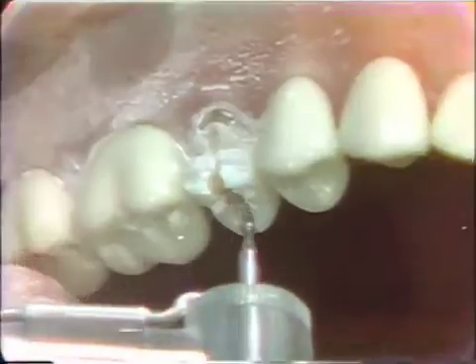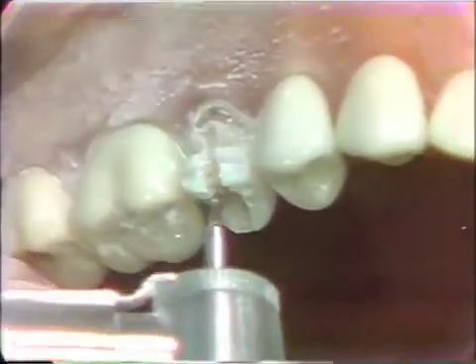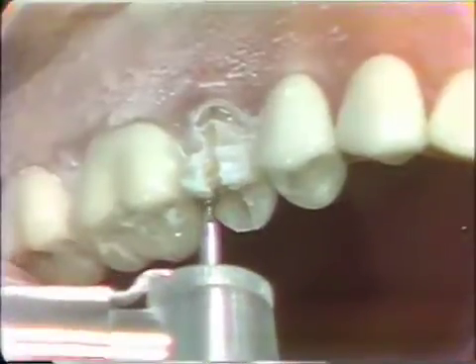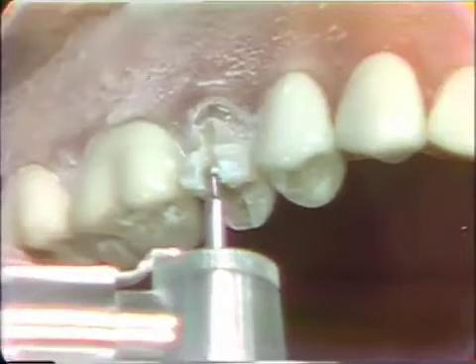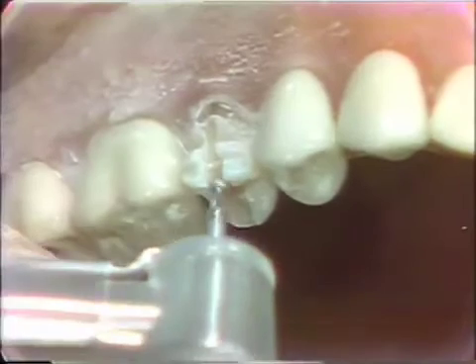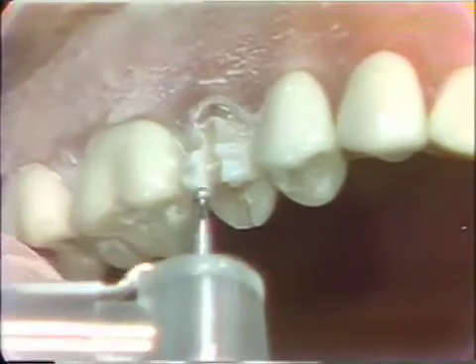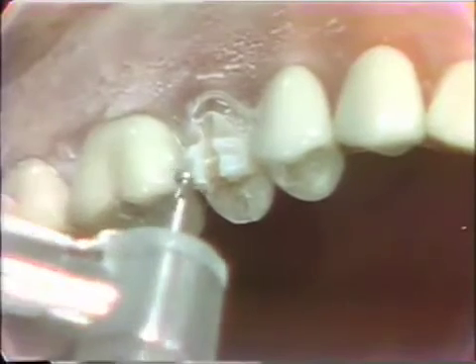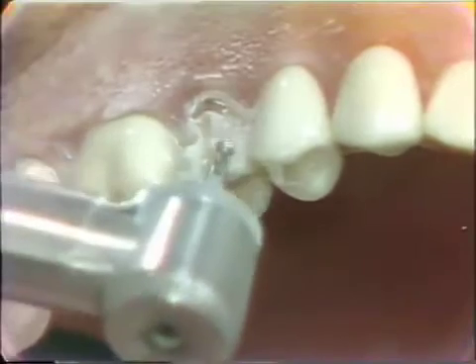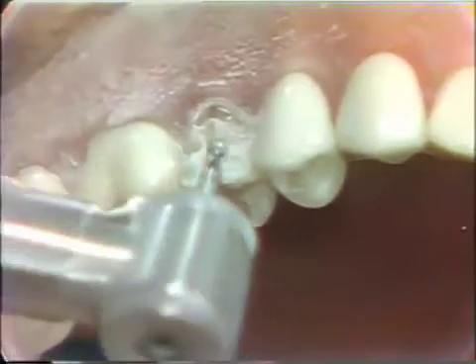In this occlusal area, we will go the full depth of the diamond bur — the full depth. We will then extend this out to the interproximal. This will allow us to get good color in this occlusal area and also to develop some good occlusal anatomy. This diamond can then be used in the embrasure and interdental space area to bring the finishing line more into the interproximal.